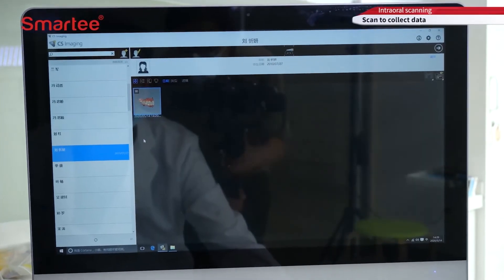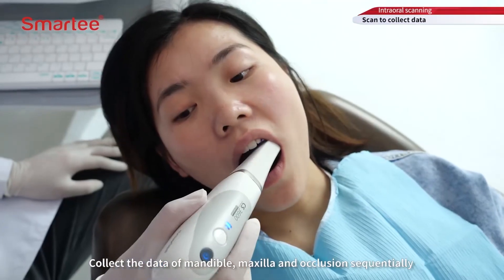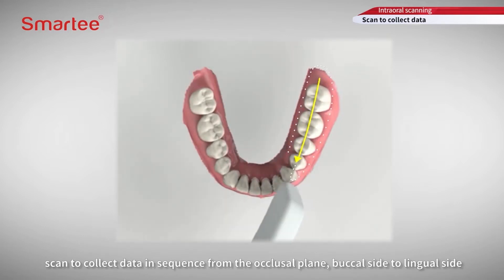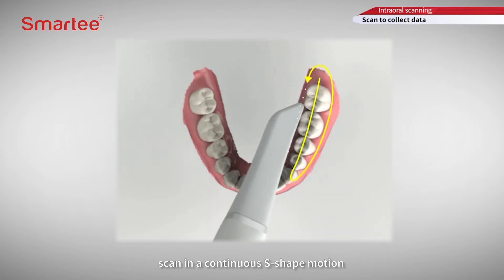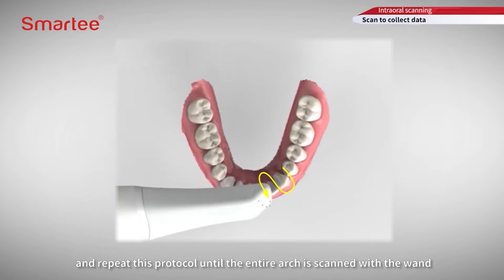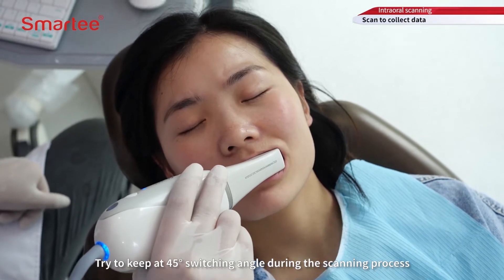Enter the data collection interface and collect the data of mandible, maxilla, and occlusion sequentially. For the posterior teeth area, scan to collect data in sequence from the occlusal plane, buccal side to lingual side. For the anterior teeth area, scan in a continuous S-shape motion: start from the incisal edge, transition to the lingual, then labial edge, and back to the incisal edge again. Repeat this protocol until the entire arch is scanned. Try to keep at 45 degrees, switching angle during the scanning process.